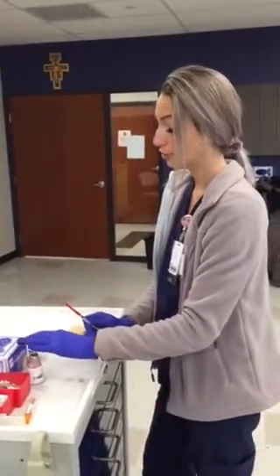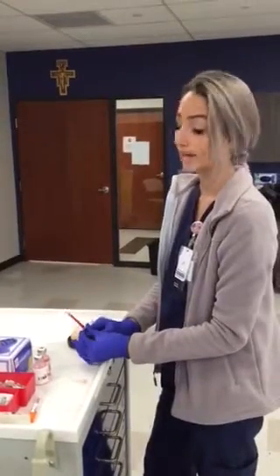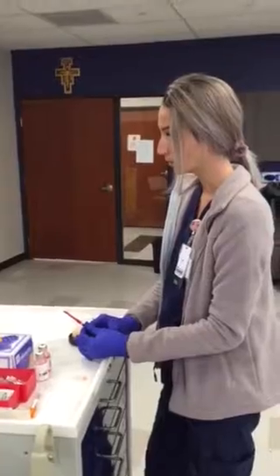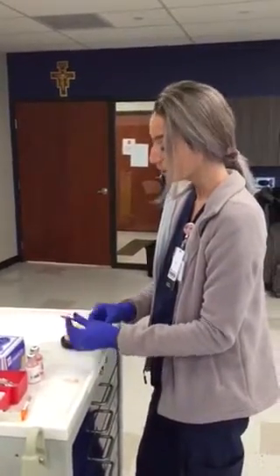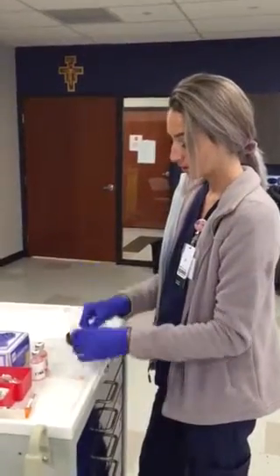Okay, so I'm gonna give 2 injections. I'm first gonna give you vitamin B12. She's gonna get 1,000 micrograms or 0.1 milligrams, 1 milligram. So I'm first going to clear this with a blunt needle.